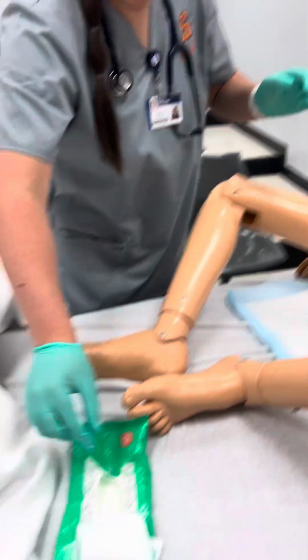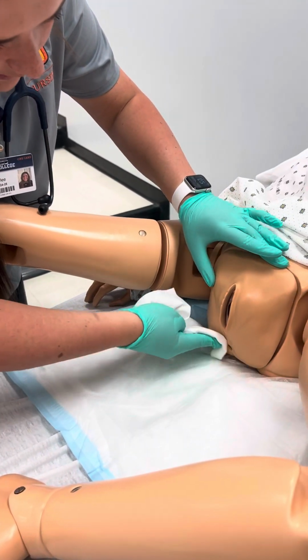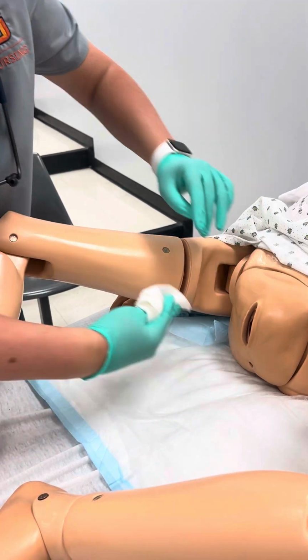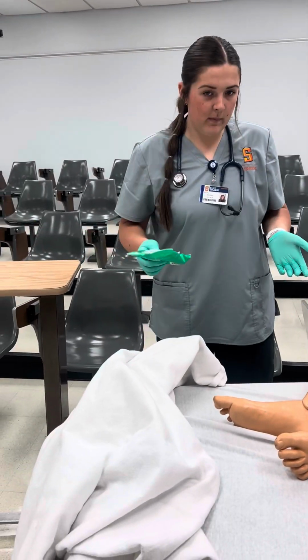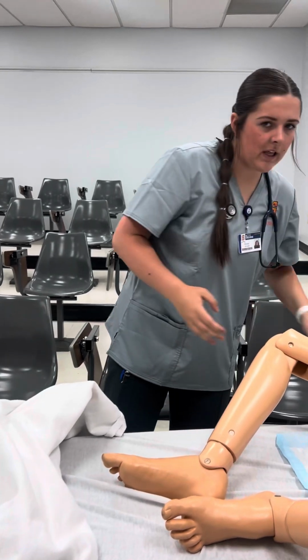I'm gonna get a new wipe, and I'm gonna clean each side really good. New side of the wipe. Perfect. Now that we are clean, I am going to prepare my sterile fields and get ready to place this catheter.